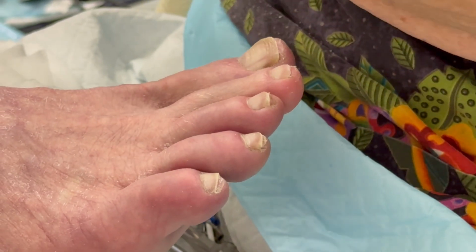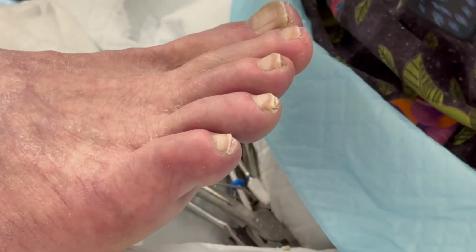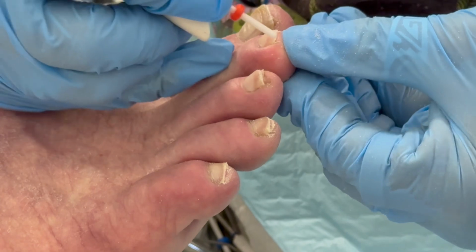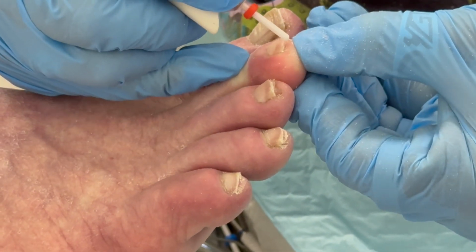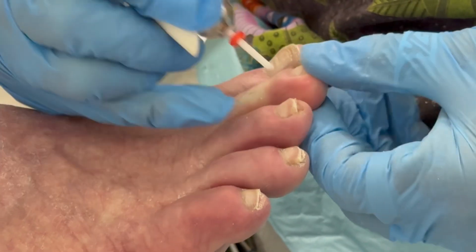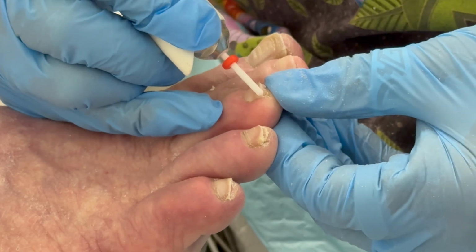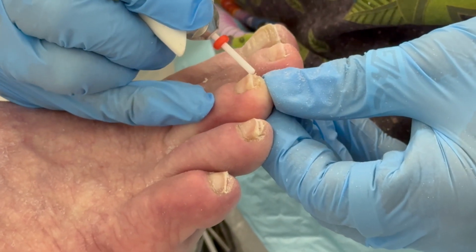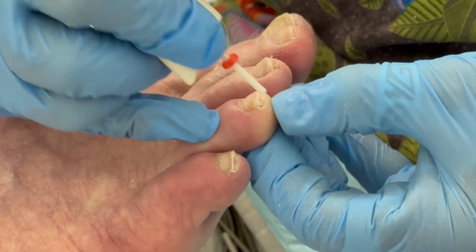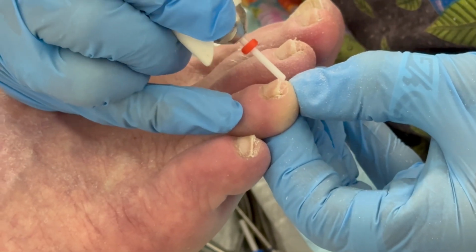Okay, and then we'll call it a video. I kind of think of this as doing eyeliner or something. You just go along the edge, clean it up a little bit. There is a little, I wouldn't say this is callus, but sort of. There's some thicker skin at the tip here, which you can either switch to a diamond burr or do this.